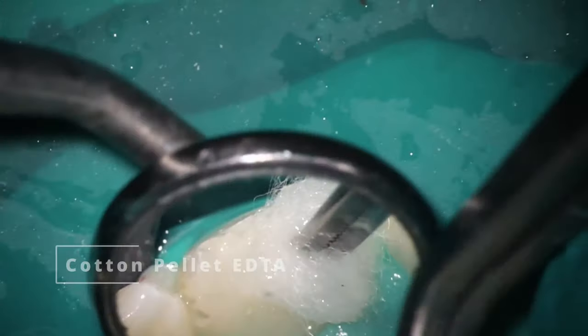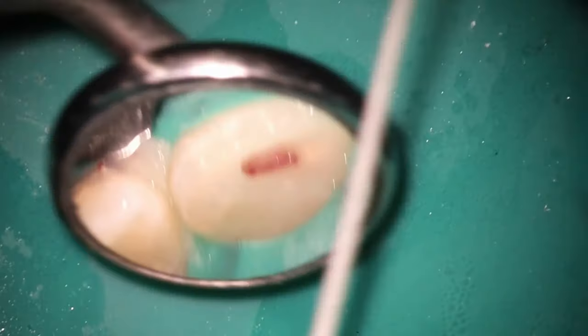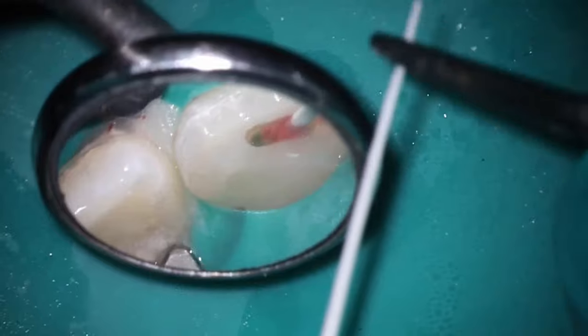And this is pretty much what it looks like as we dry everything off. So get all that debris out of there. And I'm going to put EDTA on top of there. I used to use bleach, but recent studies have shown EDTA is better at releasing stem cells. A few minutes later, I let it soak in there for about a minute or two. We have nice, healthy tissue.